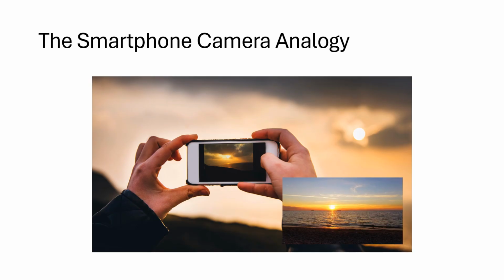Now let's compare the window width and window level to the smartphone camera analogy. Imagine you're trying to take a photo of the sunset. You adjust the camera settings to capture the perfect shot. Window width and window level in CT are the camera settings, but for X-rays.